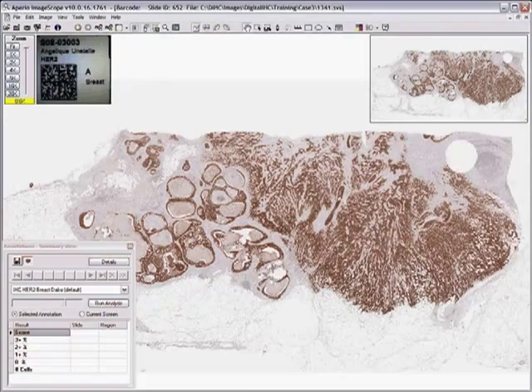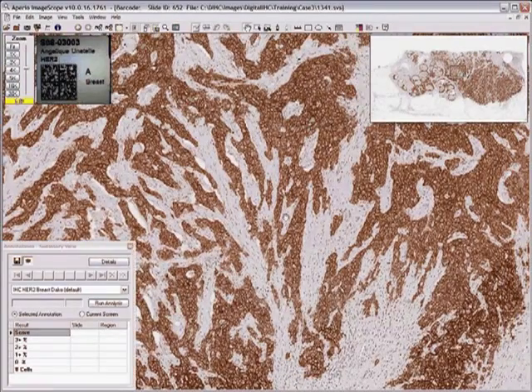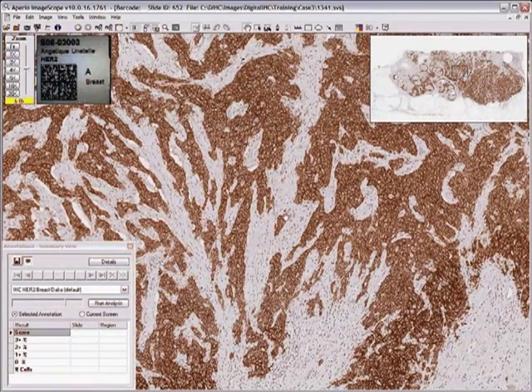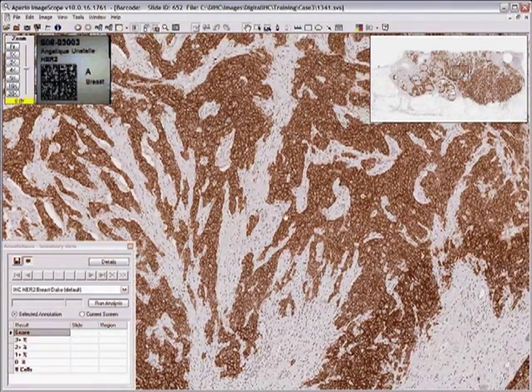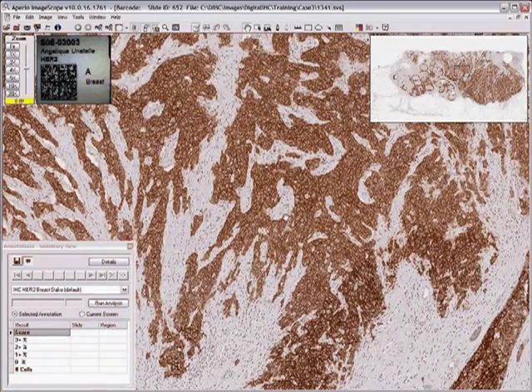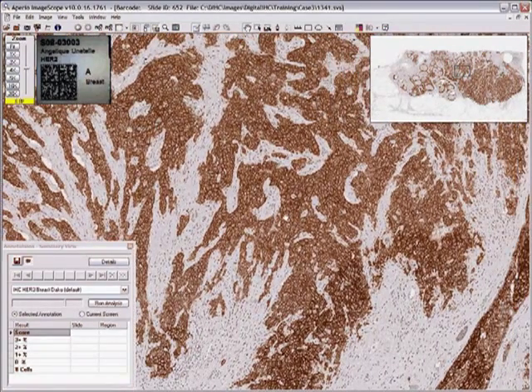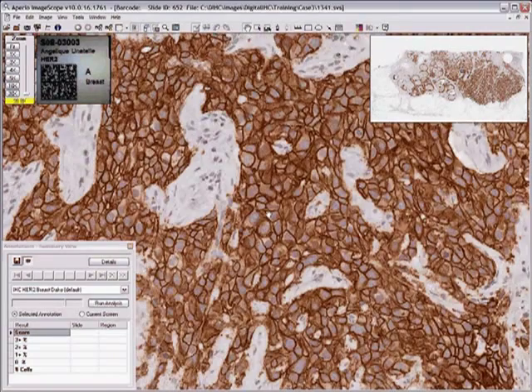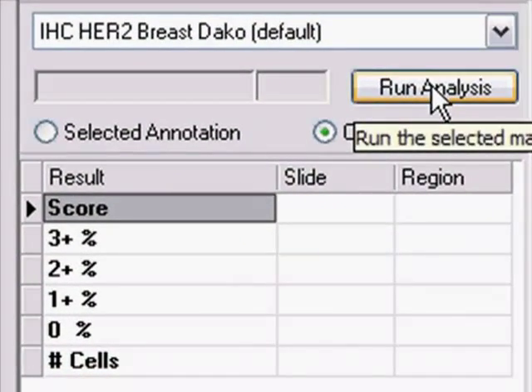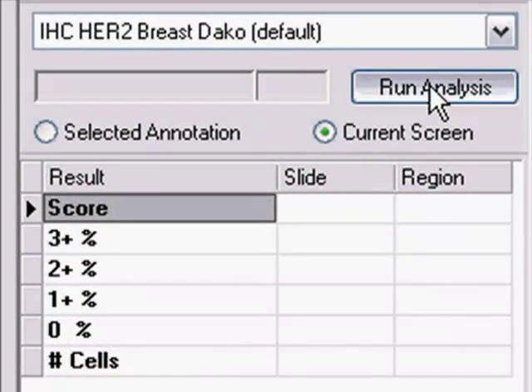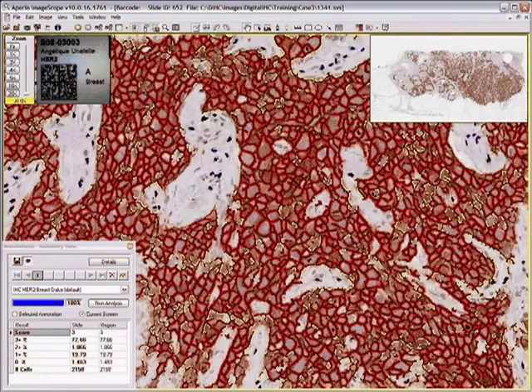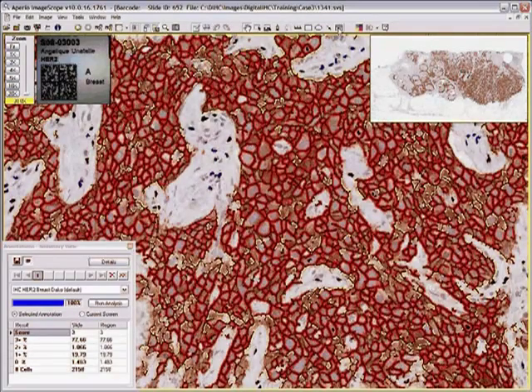Aperio provides a new approach to IHC with an all-digital workflow. While reading slides on a computer monitor, you can now use quantitative image analysis efficiently with the click of a button. Image analysis classifies and counts thousands of cells for you accurately and consistently in just seconds.